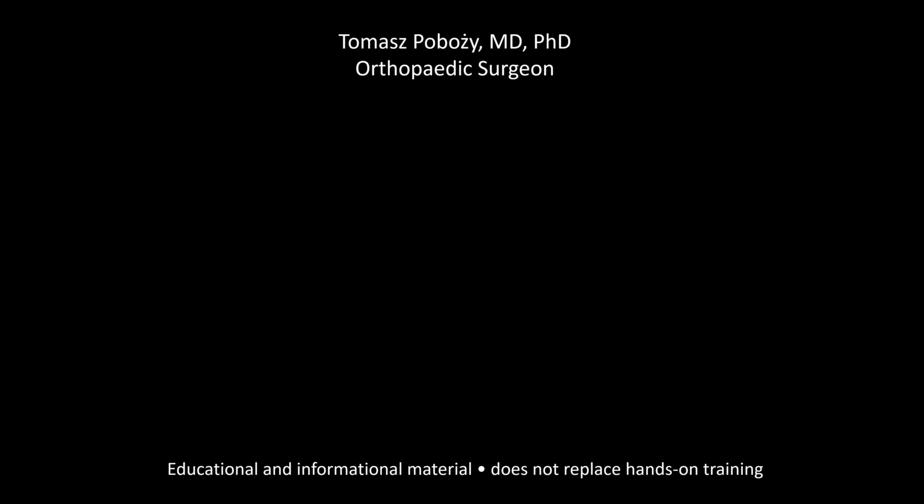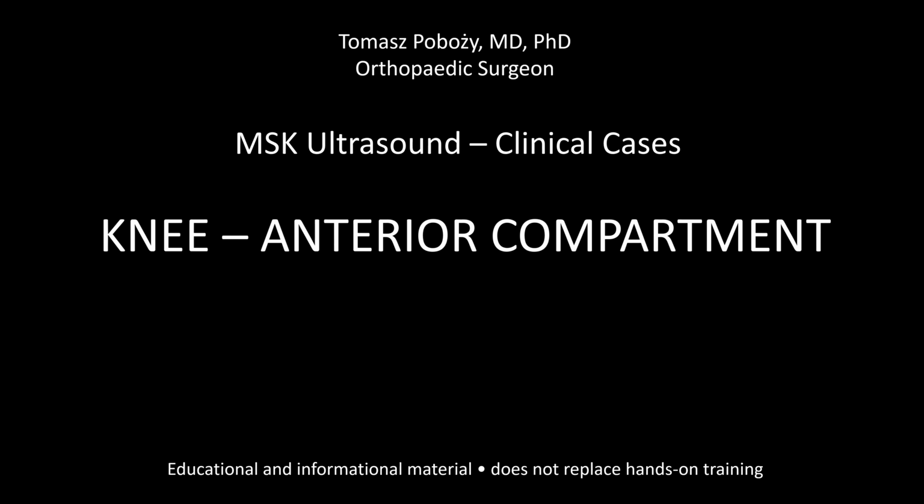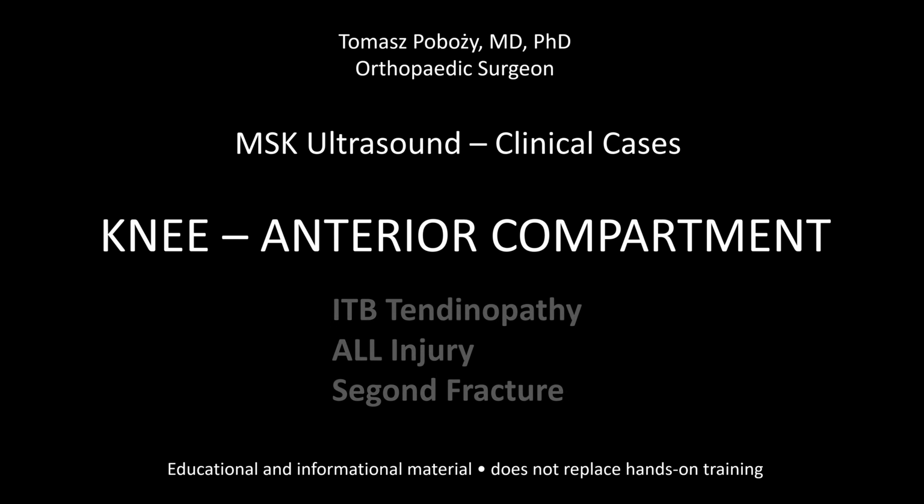This episode presents selected anterolateral knee cases, focusing on ITB tendinopathy, ALL injury, and Segond fracture in musculoskeletal ultrasound practice.